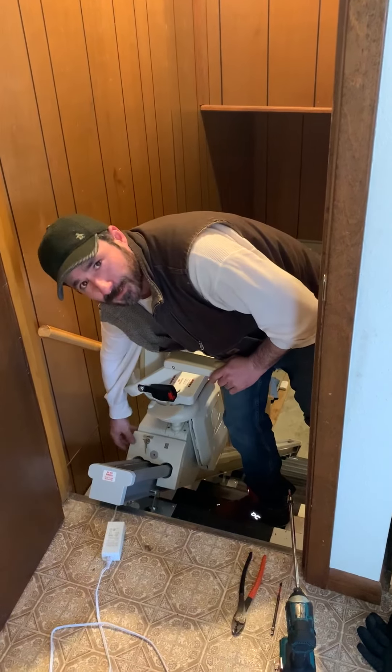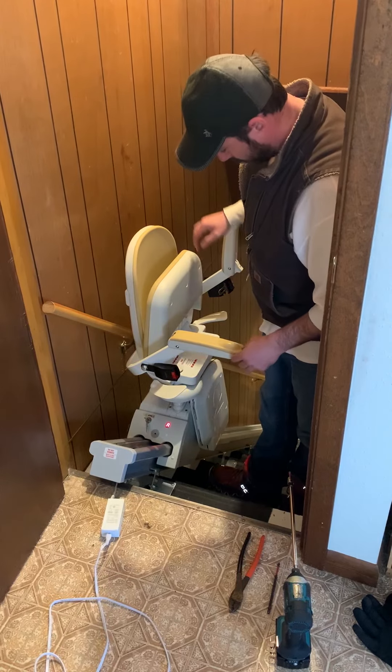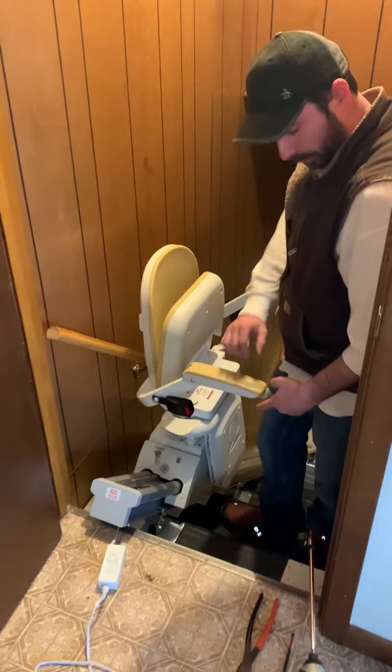Alright, let's remove a stair lift. So we want to run it up to the top. This has to be down, of course. There's a button here. Run this down a little bit.